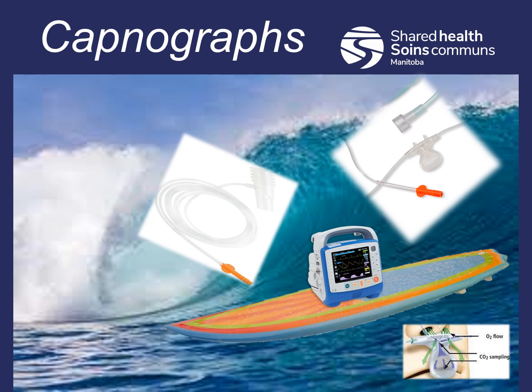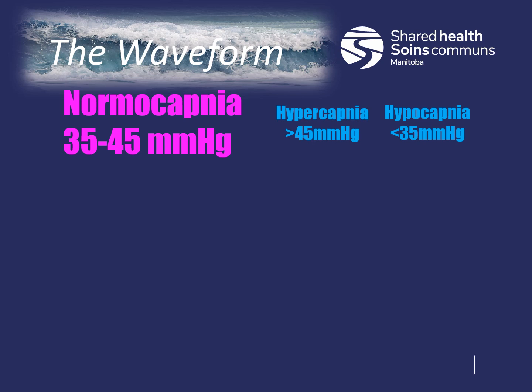The T-piece adapter is for those patients that you are creating a CPAP-like seal for, or providing ventilations with an i-gel. Let's utilize capnography. Again, we're getting instantaneous feedback on the quality of the ventilations being provided and how well any treatment we are providing is affecting that patient. We won't get used to capnography or become comfortable with it unless we use it and apply it to our clinical decision-making process. Let's look at the waveform and everything we can learn from it.